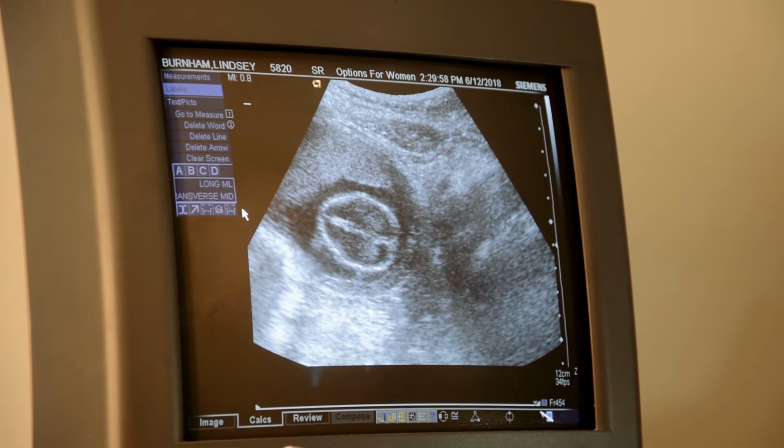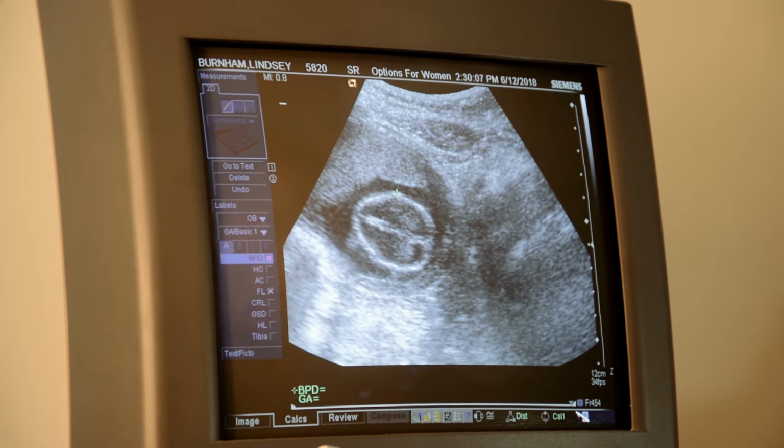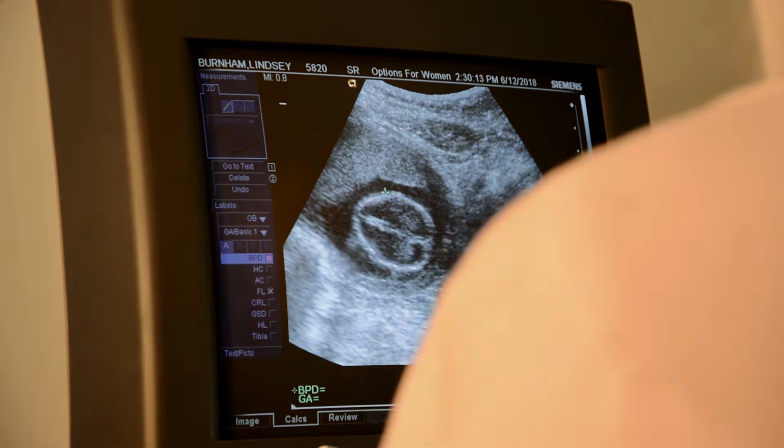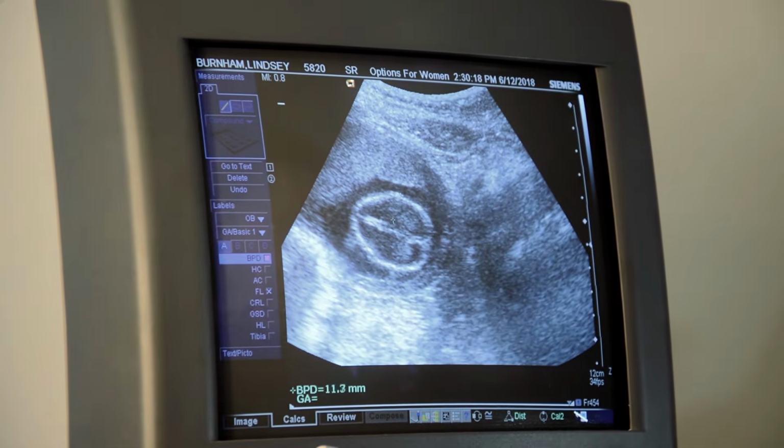Can I measure? Do we need a measurement? Yeah. This is really, see how there's that extra white right there? Would you measure that anyway? Yeah, go right there. He's just got big ears. Inner. Yep. Is that good? Yep. Okay, 15 weeks, 2 days.